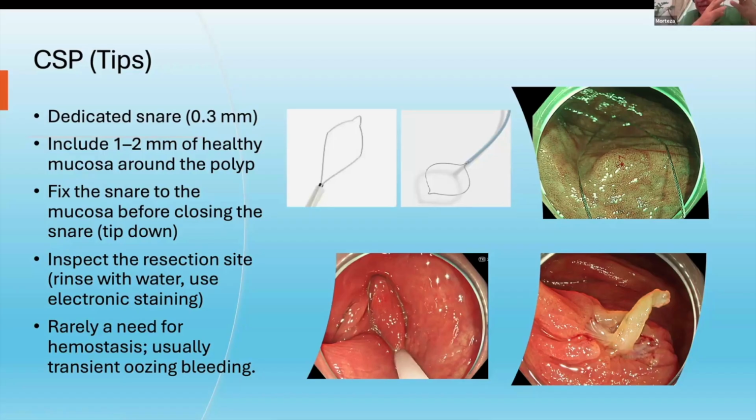There are a couple of snares that I have actually used, especially when you are working in a fold in the right colon, etc. Once you're going to close it, you see the tip of the snare is just tipping upward unnecessarily. You cannot do a good polypectomy. So basically, those three are important for me, no matter what brand it is. And I fully agree with you.